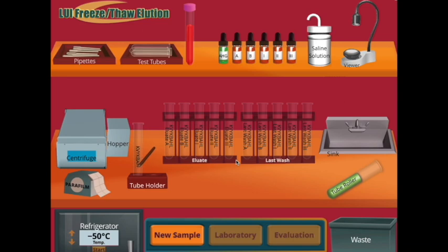Since this procedure is fairly long and complicated, this video guide will only cover the basics of the procedure and refers you to Lesson 1 covering this topic for the exact steps for completing the elution. The 8 major parts of this process include preparing the sample, washing the sample, some additional sample preparation, the freeze-thaw process, preparing the last wash and elution sets, adding cells, incubation and centrifuging, and preparing the samples for observation.